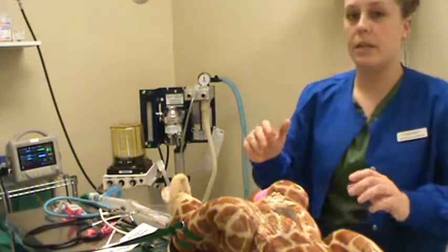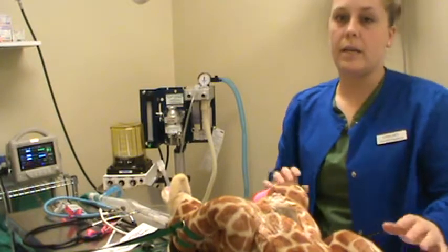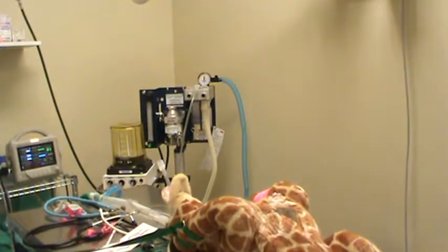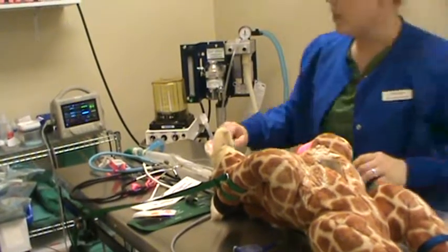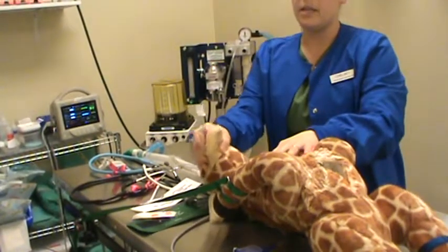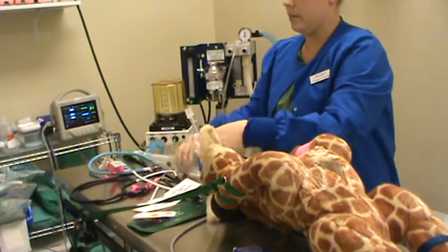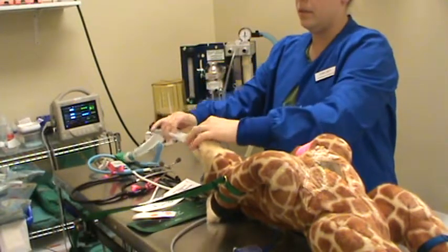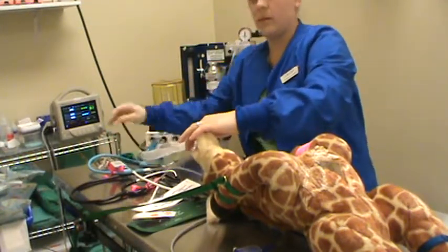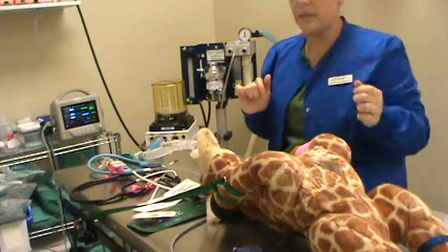I have my patient here, my little giraffe, tied down as a visual aid so we can see the equipment in use, even though it's not going to actually work. First thing I want to show you is that we have our patient properly intubated, and we're going to connect to the anesthesia circuit here. We have a little patient, so we're going to use this non-rebreather. It's under 7 kgs.